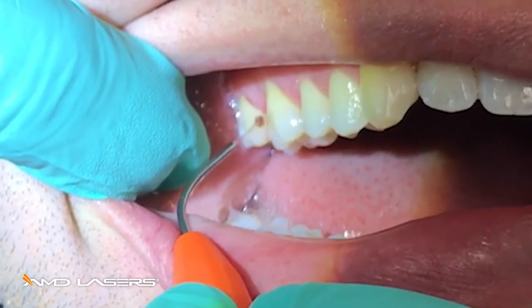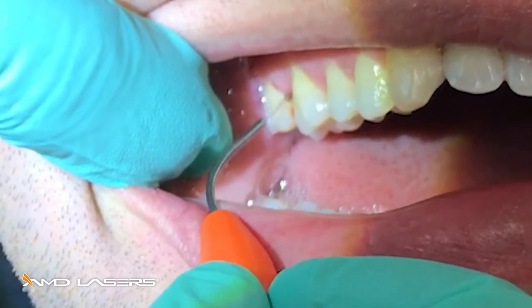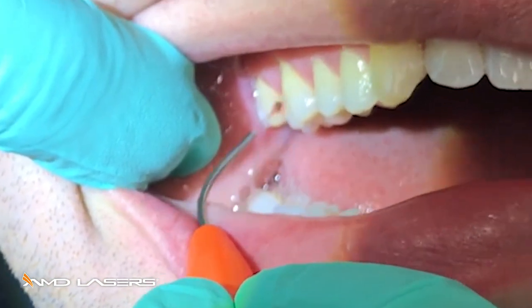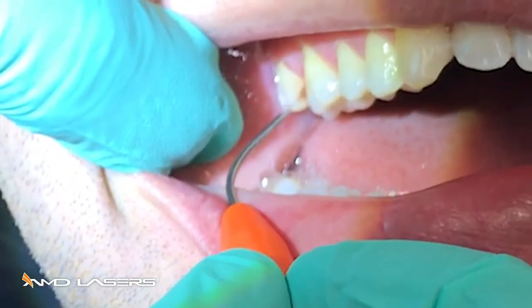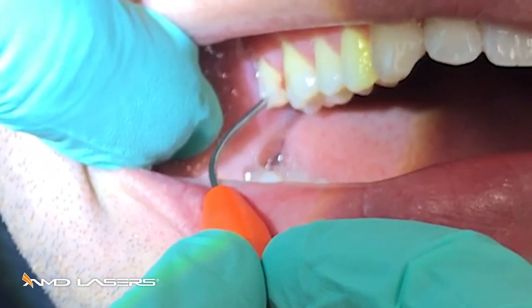If you give the tissue a little rest, the energy is going to the dark, inflamed, necrotic tissue, because the laser energy is not attracted to the pink, firm, healthy tissue. Remember, your diode energy is attracted mainly to melanin and hemoglobin.